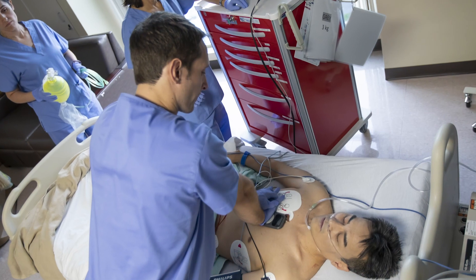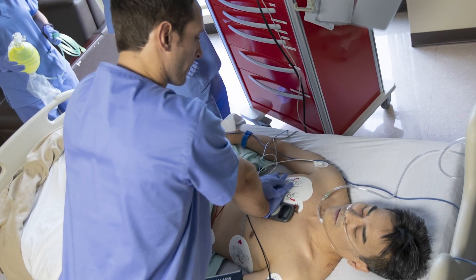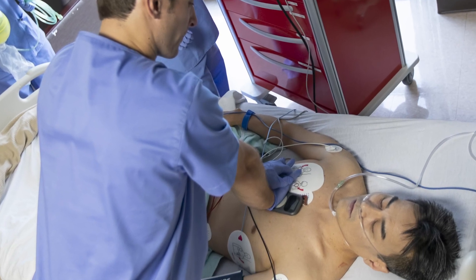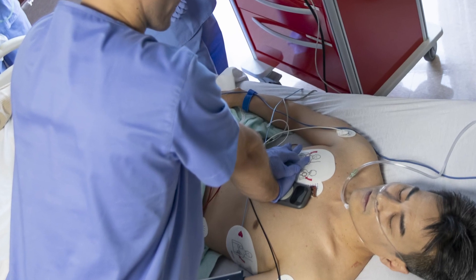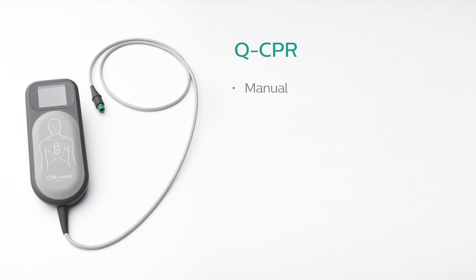The Q-CPR option offers real-time measurement and corrective feedback on the rate, depth, complete release of compressions, ventilation rate, and lack of CPR activity in accordance with current CPR guidelines. Q-CPR is available in manual defibrillation mode, AED mode, and PACER mode.